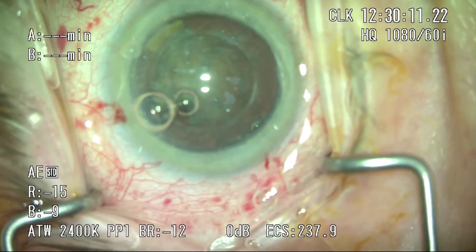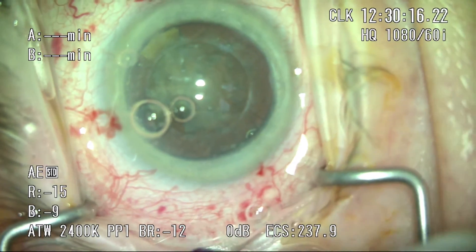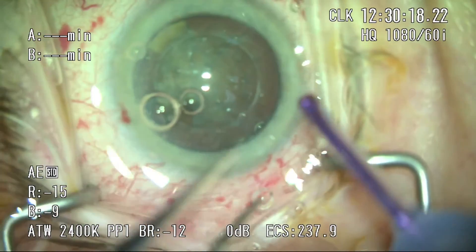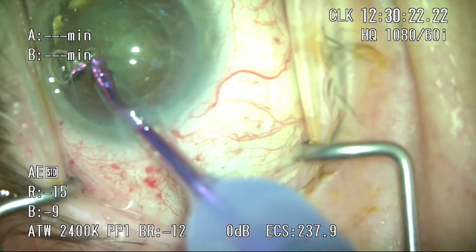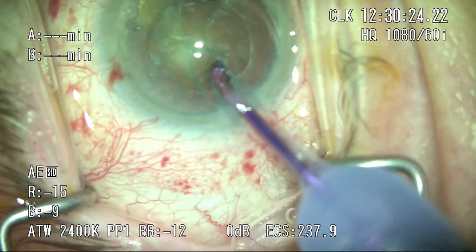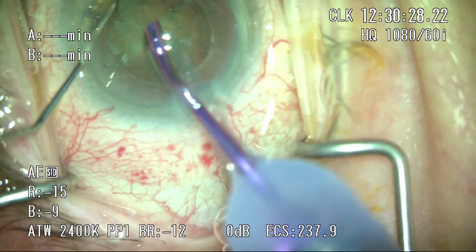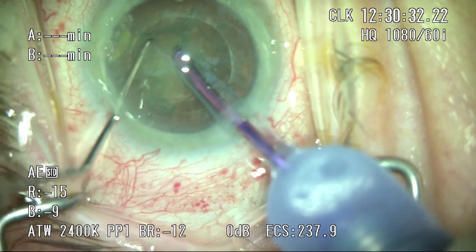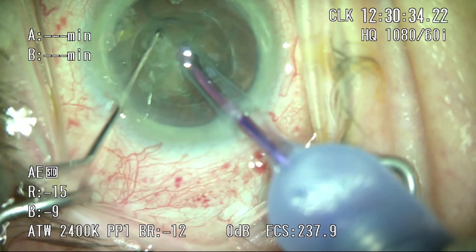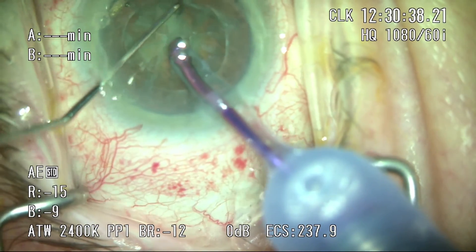Bringing in the phaco tip, I do like the MICS system, the only caveat being that it does take a little longer to adjust the sleeve. I like to hold onto the main wound as I put the phaco tip into the anterior chamber, which gives me good stability. Bringing in my chopper, I get rid of the bubble and start disassembling the nucleus. I like to quick chop all my lenses in traditional phaco, and I'm just grabbing a bit of the lens and using the chopper in the crevice already created by the Femto — you can see how clean those cuts are.